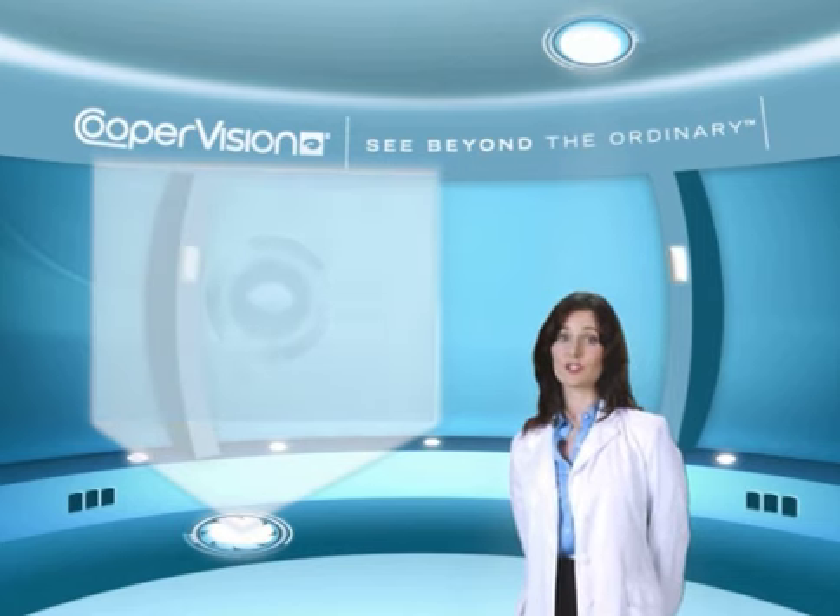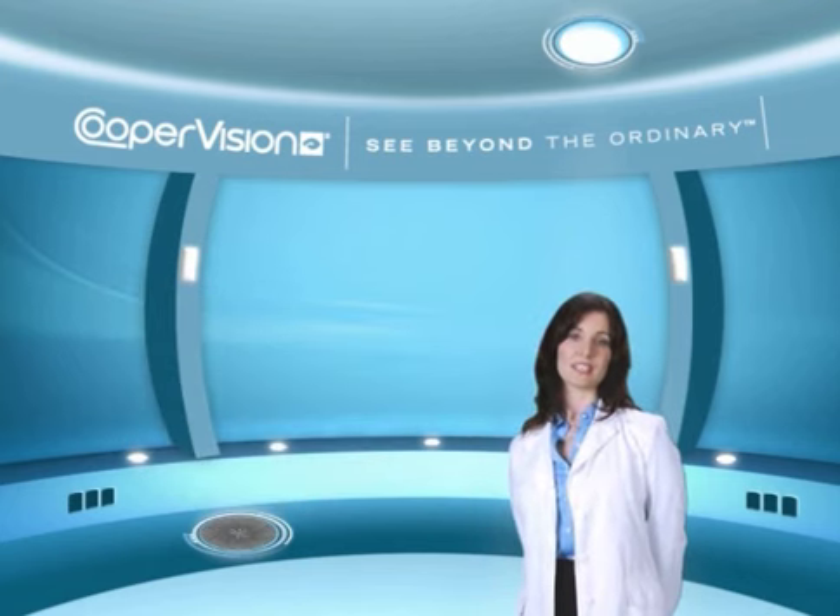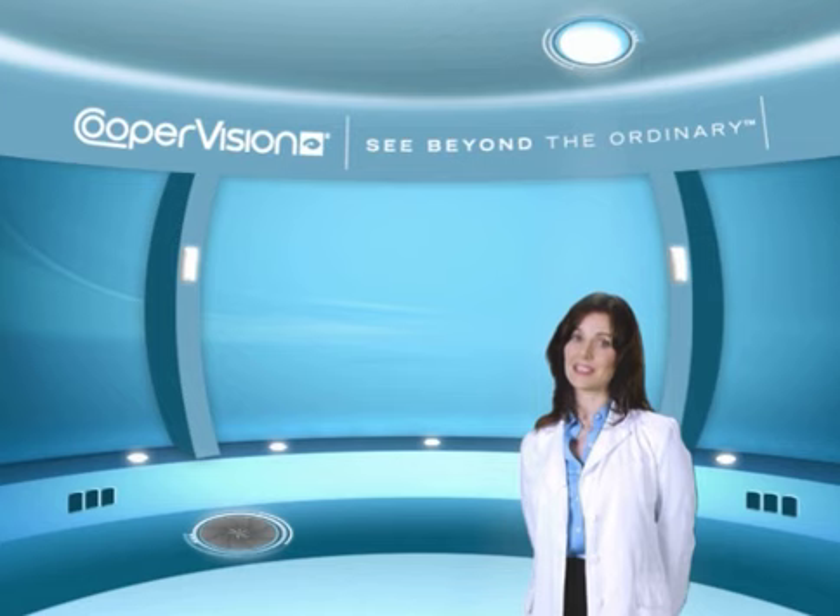Be sure to check your contact lens solution for minimum soaking requirements. When you've removed and cleaned your right contact lens, repeat this process with the lens in your left eye.